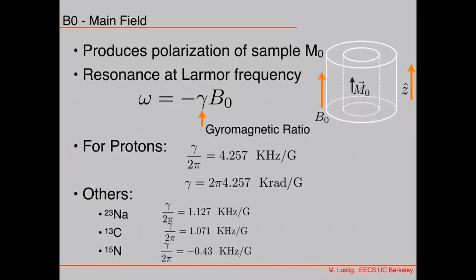This is going to have a certain issue, because when we talk about excitation fields, we're talking about a polarized field, a circularly polarized field. And so the direction, whether negative or positive, makes a big difference. You really have to create an excitation with the right polarization, and the polarization needs to have a particular sign. Okay, so we're going to talk a little bit about that.